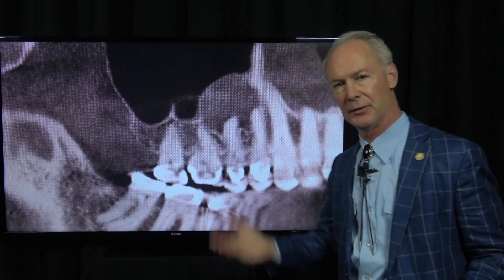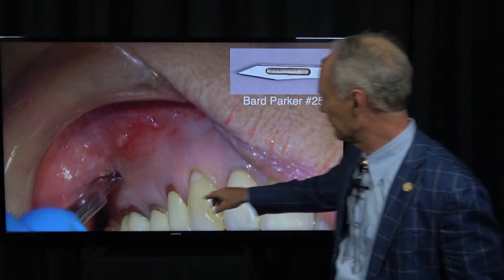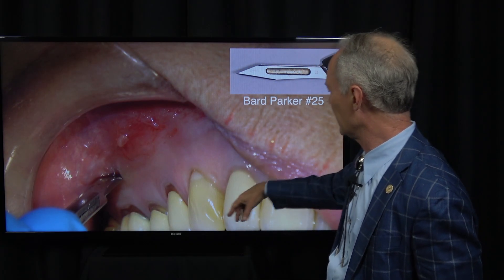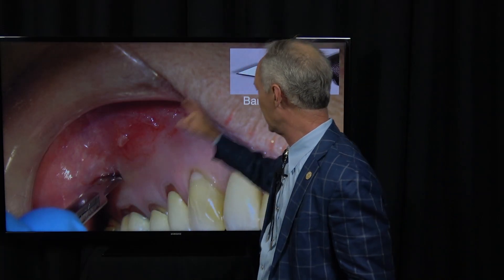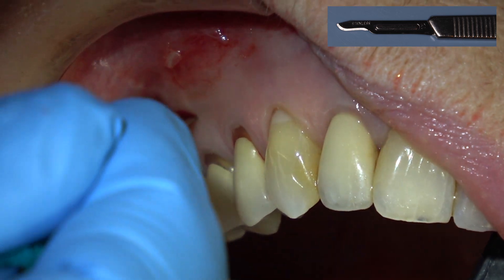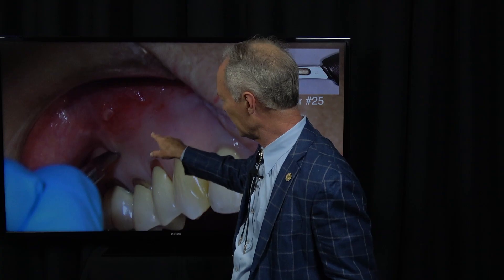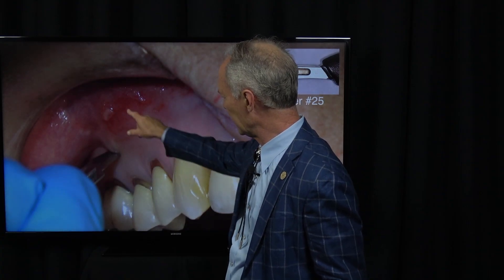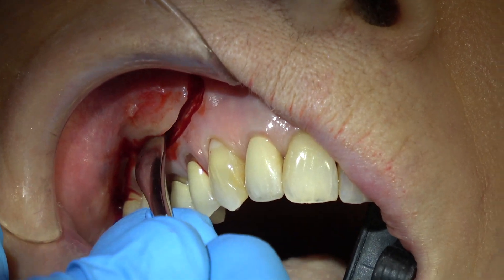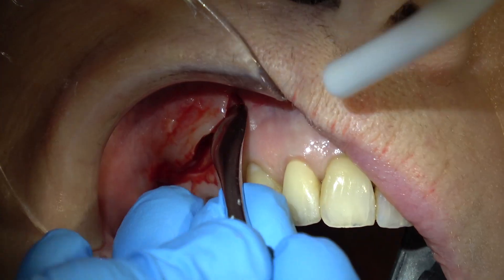It was causing the patient quite a bit of pain from the pressure. I'm using a 15 Bard-Parker — you can use a 25, but this is a 15, a round tip. I'm making an elliptical incision coronal to the lesion. This part of the bone is not affected by the abscess. Make an incision large enough that you can reflect a large enough flap to have access to the lesion.